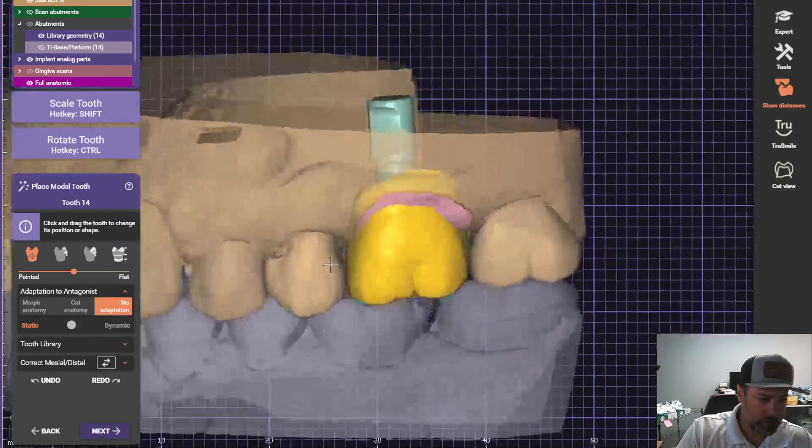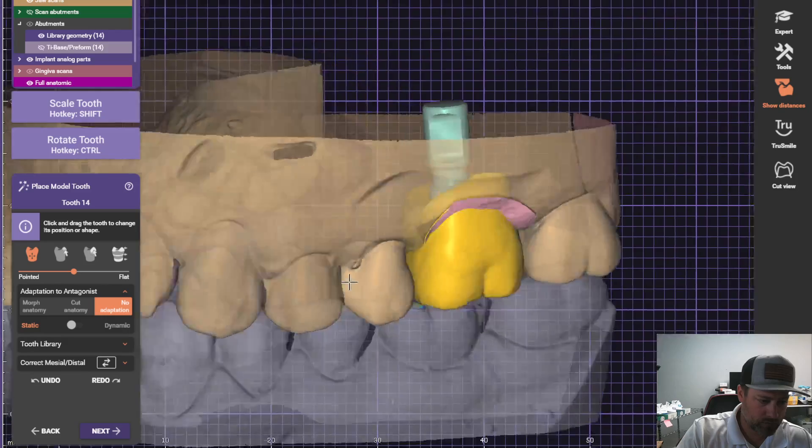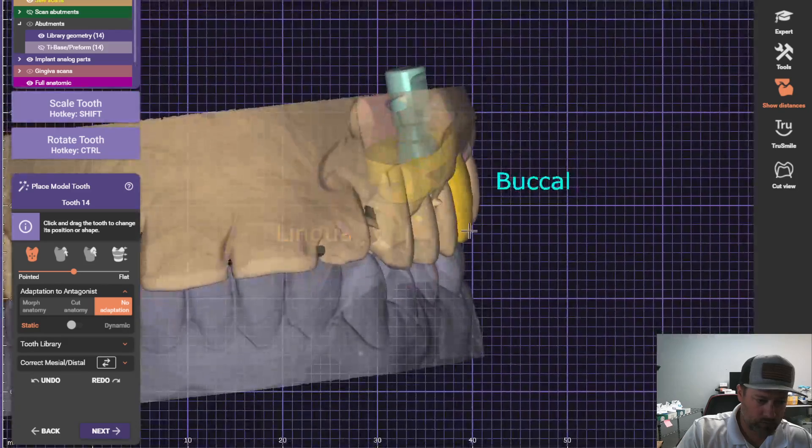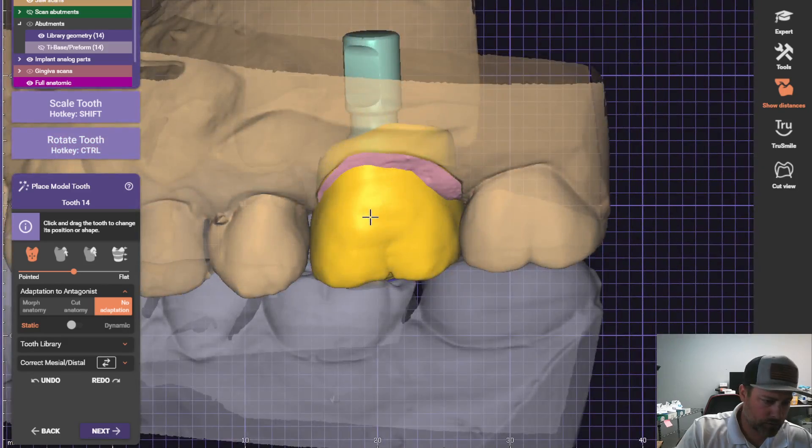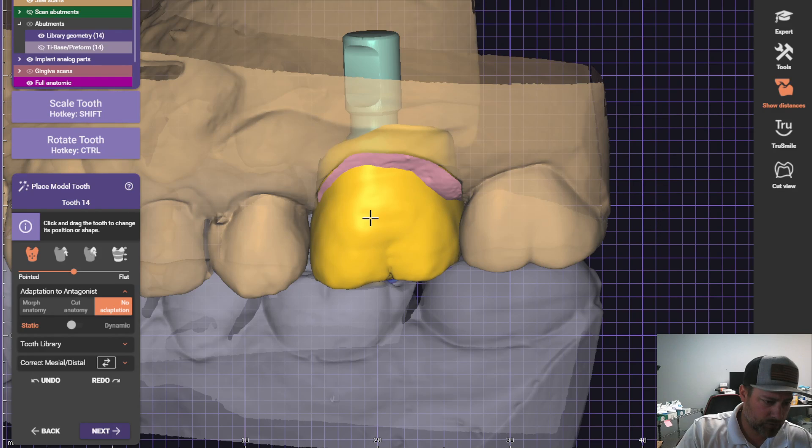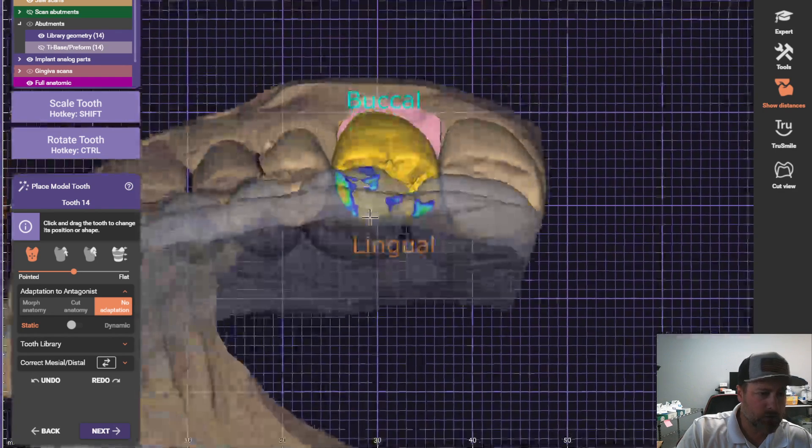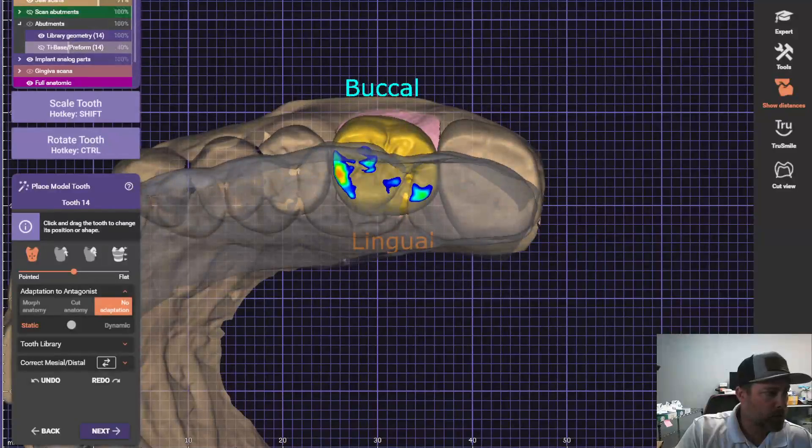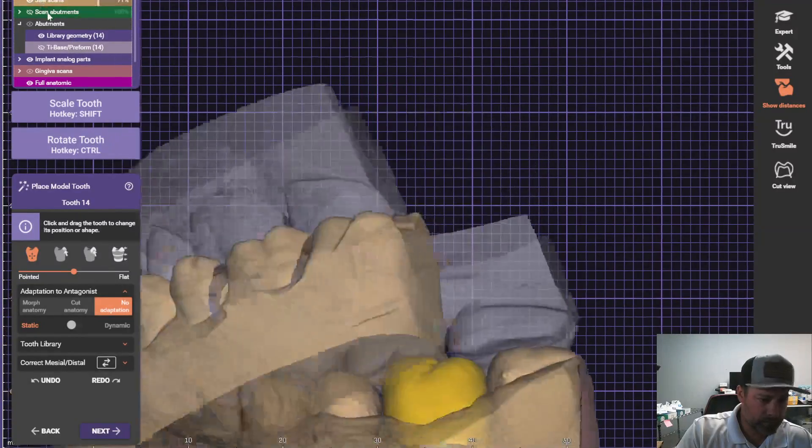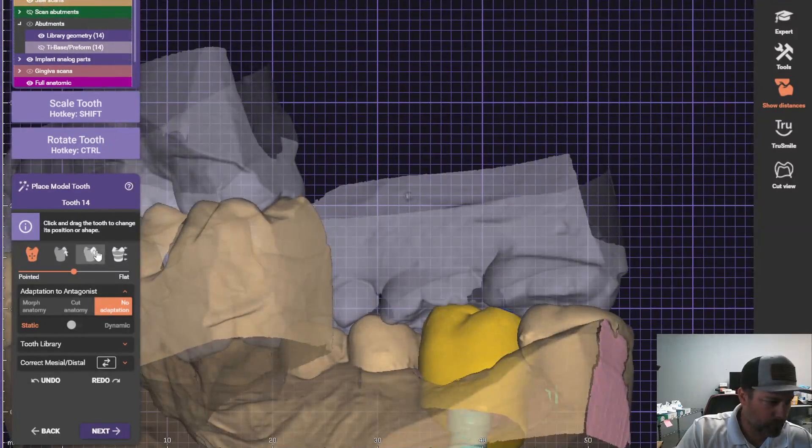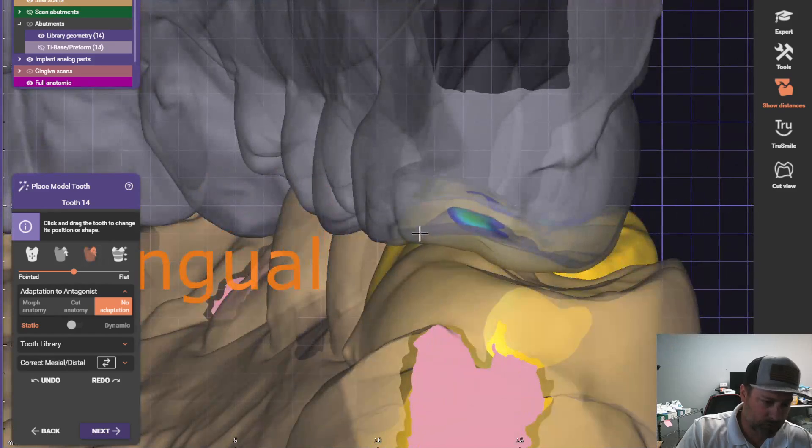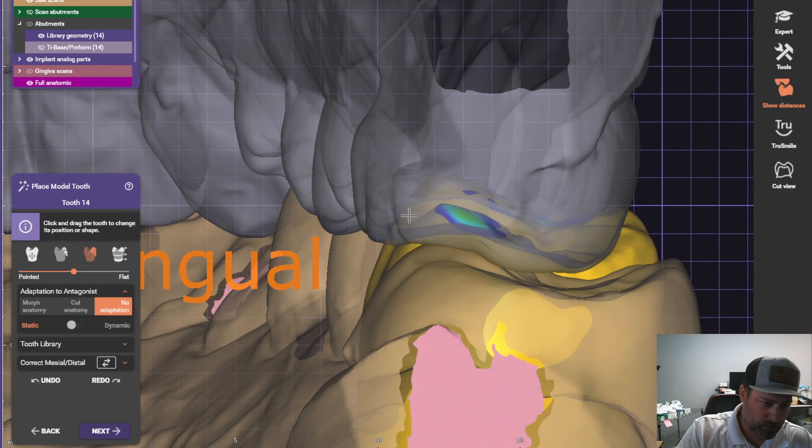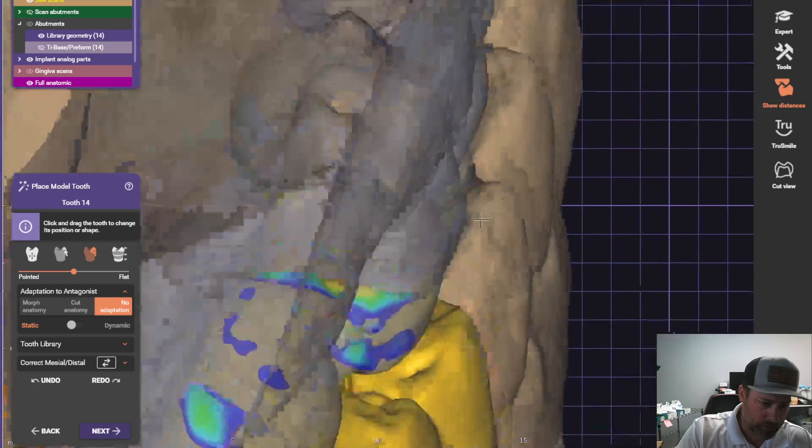Check these inside the edges. This will also allow us to do a split file so we can mill out the crown at the same time that we mill out the abutment. So that's why I'm designing this one more carefully.